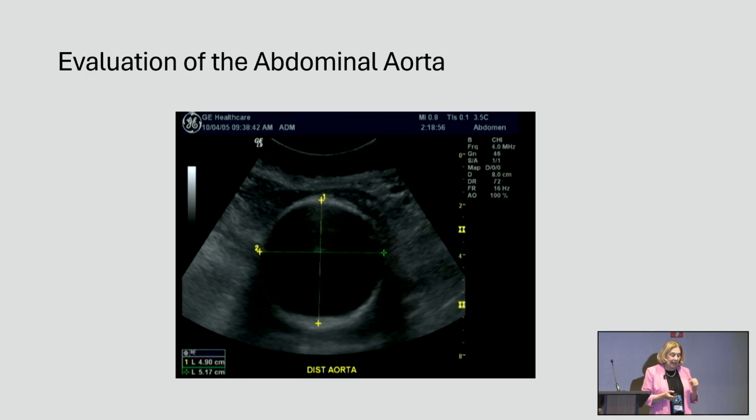One of the things I have found to be very important in any lab: now does everyone think this was placed just where you would place them? Close, but maybe the one that goes laterally is a little bit high. It's not, but we have edge shadowing too.